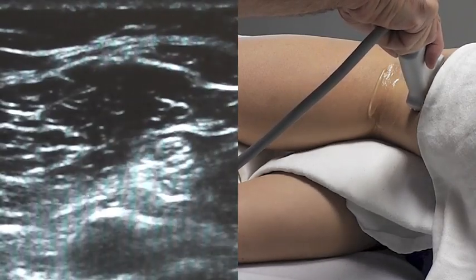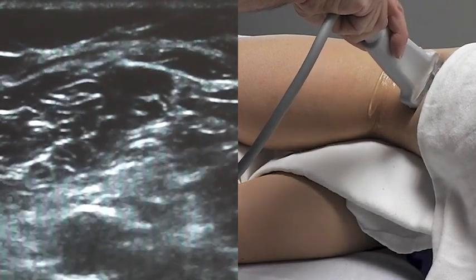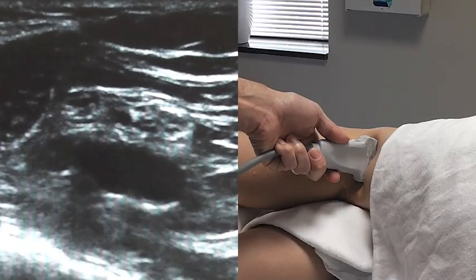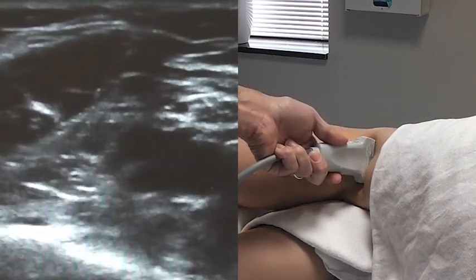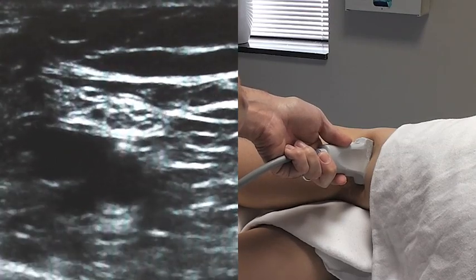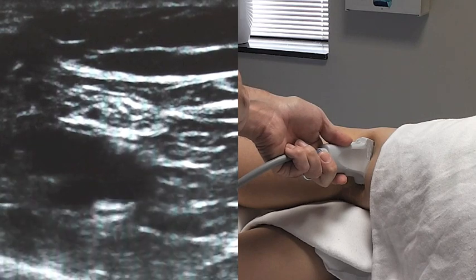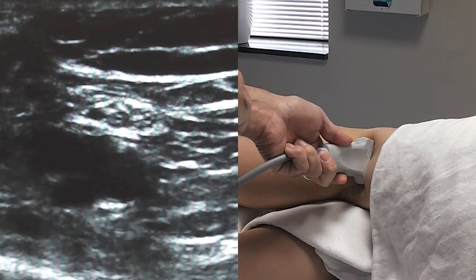Look what happens as I gently move my probe — I've lost the view of the nerve altogether. Moving the probe slightly backward toward me, I've now reacquired it. Subtle movements make enormous differences when doing blocks. We're often asked about needle placement and where we do the injection on skin. What I'm interested in is to see how deep the nerve is relative to the skin and probe. You can see the nerve there, and the setting on this machine is currently 3.3 cm. The nerve is sitting at almost mid-screen, which means you're going to be at about 1.75 cm.